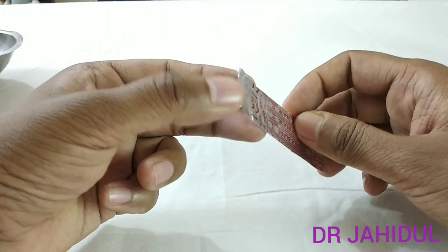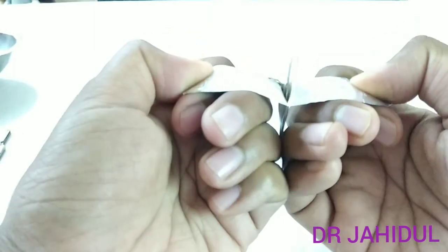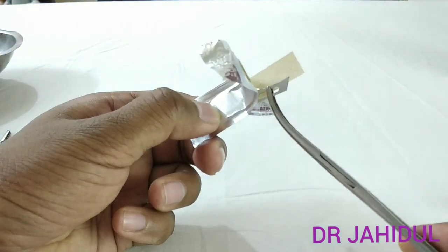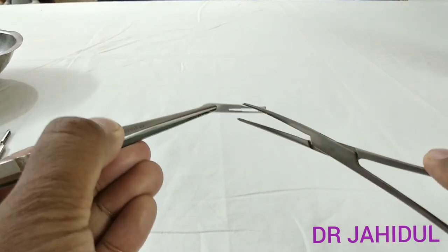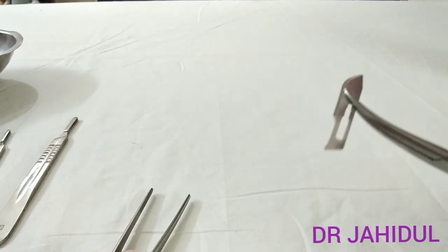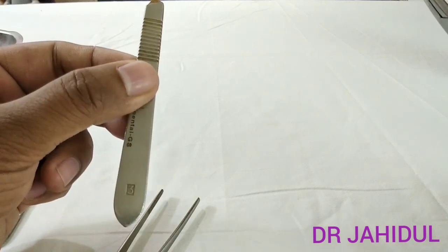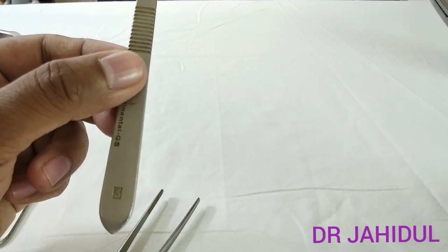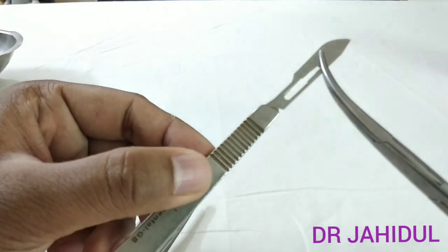The technique of opening the foil of a surgical blade is to pull it back and then hold the blade with hemostatic forceps. Then position the blade with the help of dissecting forceps. This is a number 10 size blade — it will be attached with handle number 3. Remember that handle number 3 is for blade numbers 10, 11, 12, and 15. This blade will be engaged in this slot.